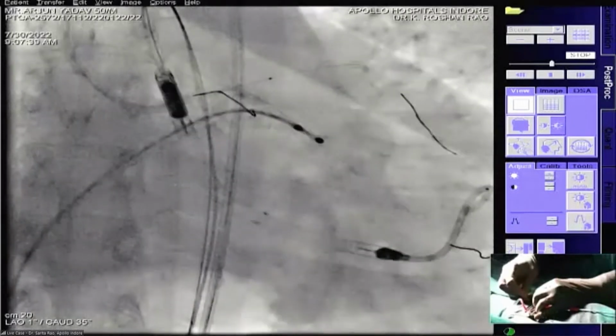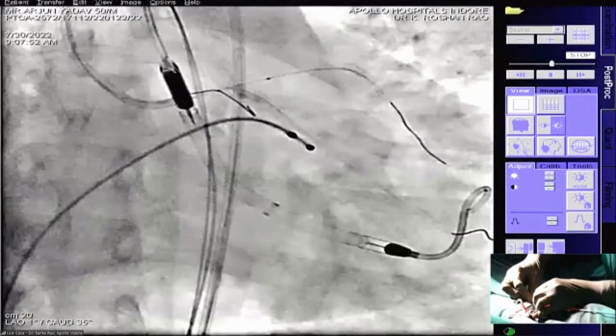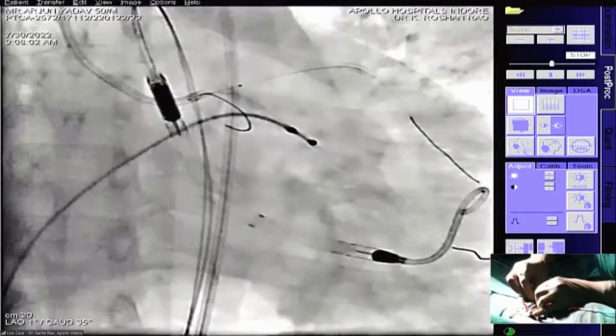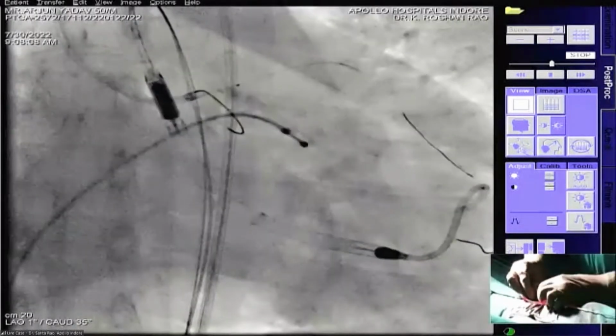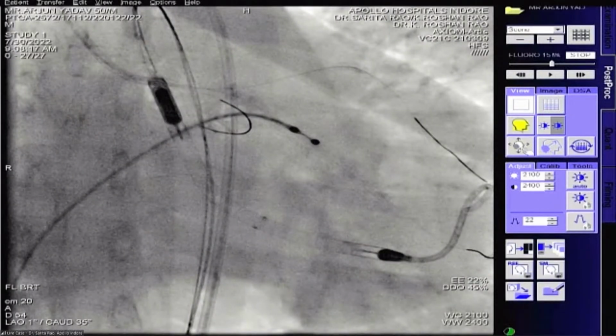While you're inflating the left main, could you show us the hemodynamics on the impeller at the same time, please? And the console. Boost. So we had a temporary flat line. Use the boost. My pressures are now back. Now again have a pressure of 96.